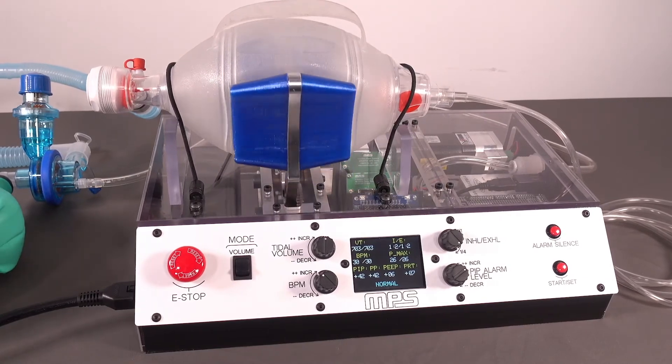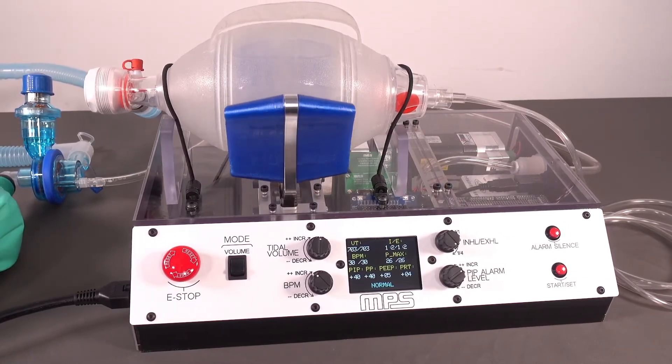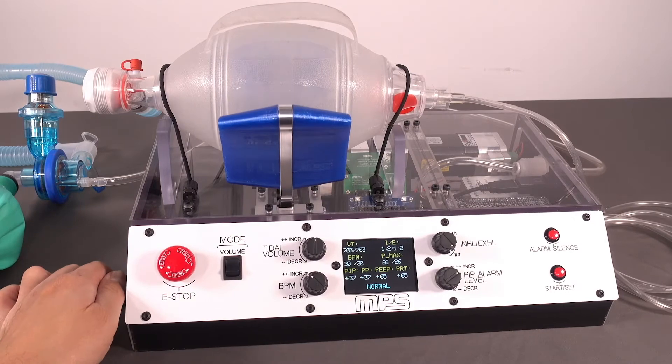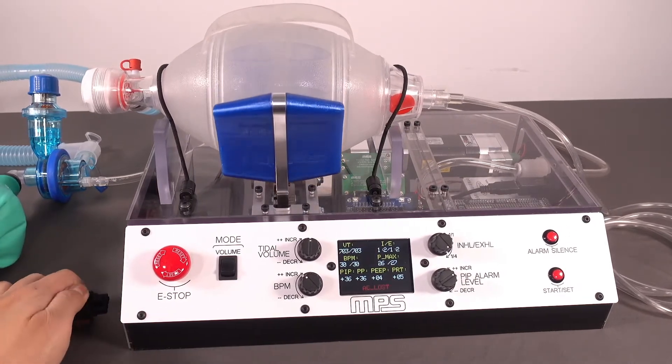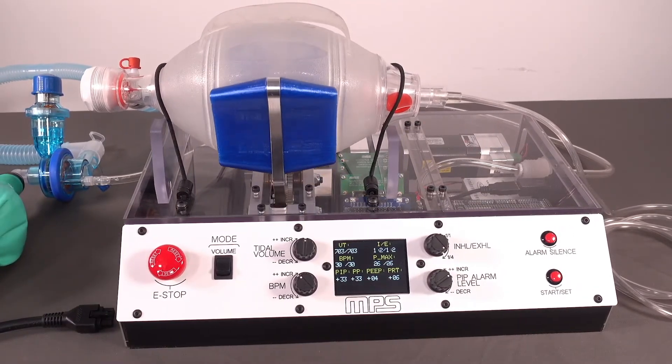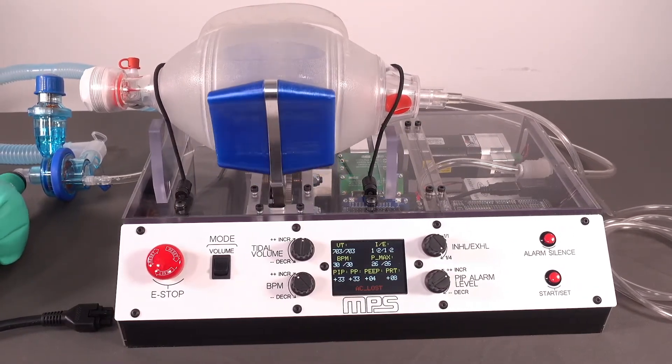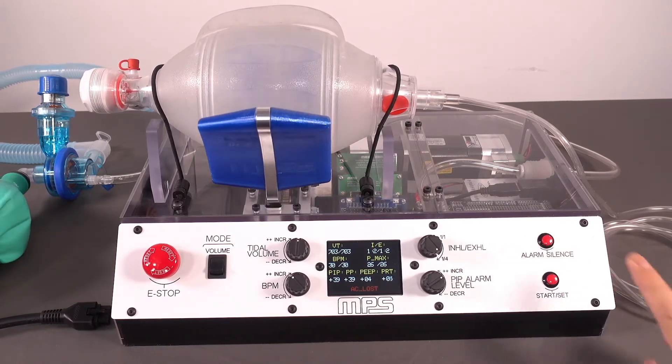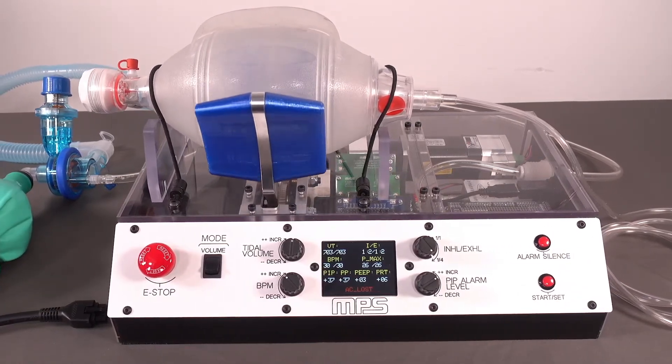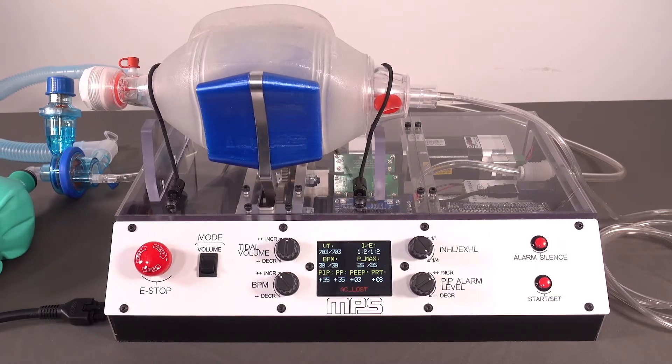If AC power is lost, our system sounds an audible alarm and seamlessly transfers the power path to the backup battery. The alarm can be silenced, but the panel notification will remain active until AC power is restored.